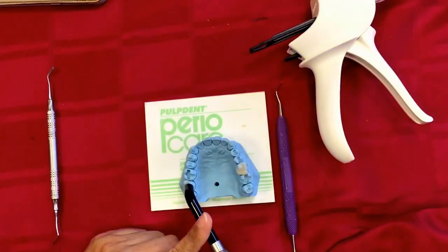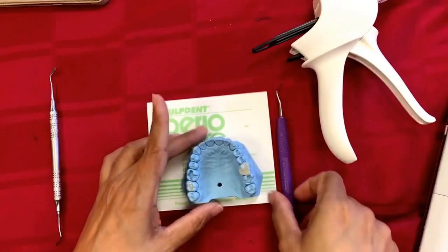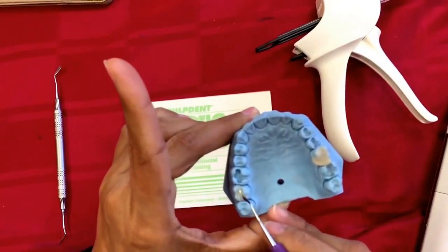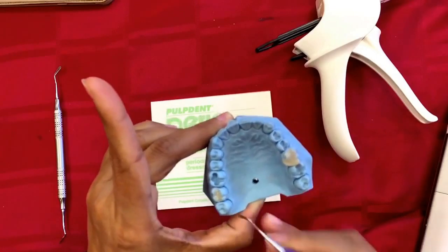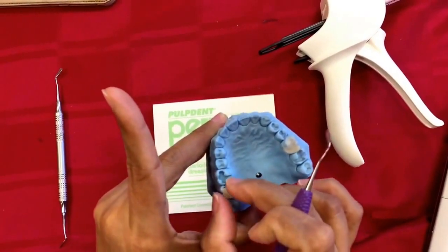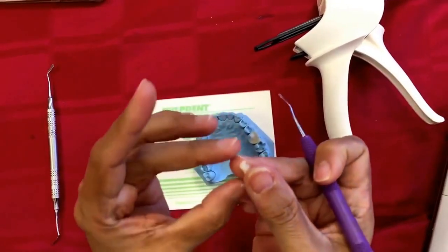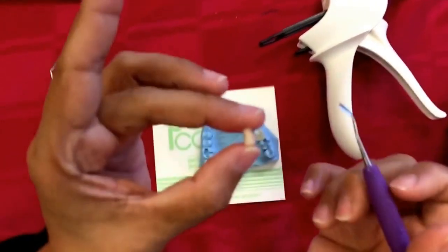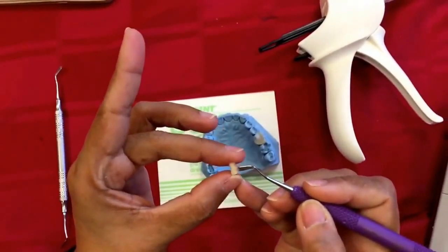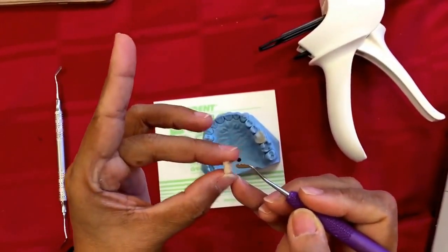Light curing is done. Let's check — this is the completely cured Activa. If I may take the liberty of removing it from this model and showing you what the underside of the restoration looks like — you can see there are no bubbles anywhere, and it integrates completely with all the nooks and corners of any kind of prep.